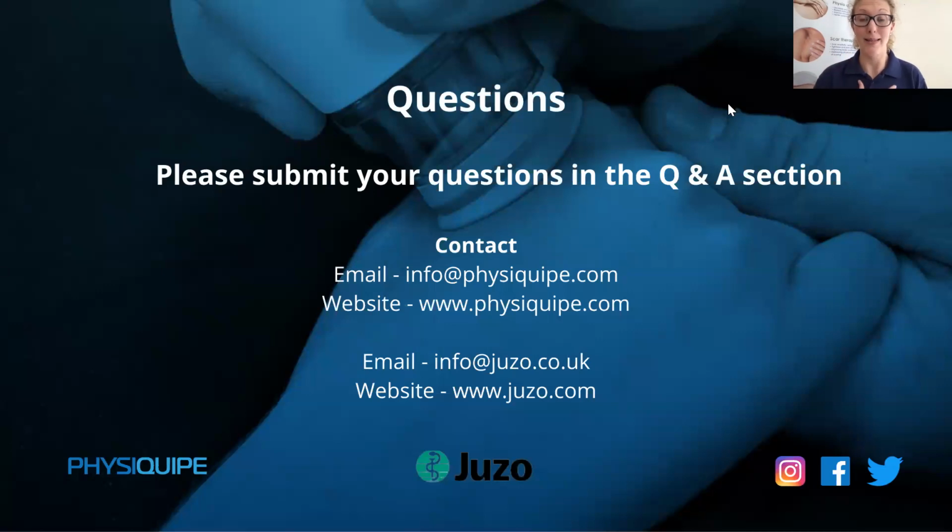Exactly how you would clinically reason anything, whether providing massage, trigger points or exercises. What do you want to target? I wanted to target getting the scar relaxed, more mobile, less pain. How am I going to get less pain? I'm going to desensitize the scar. I'm going to use the LymphaTouch machine to help get fluid movement in the scar, work around the scar, and help get better knee extension, so your hamstrings aren't so tight, your gastrocs and soleus aren't impacted, and use the machine in conjunction with stretching, mobilization, exercises and gentle hands-on therapy.